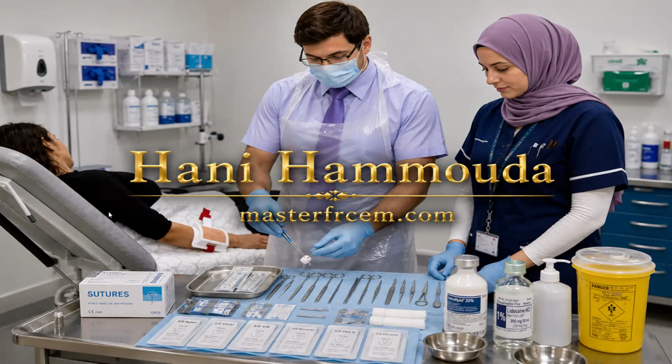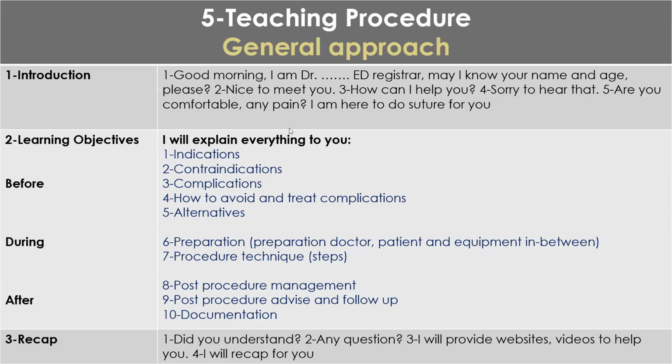Introduce yourself to the patient as usual, like any history. You will say, "Good morning," and so on. May I know your name and the age? Nice to meet you. Then smile. How can I help you? Oh, sorry to hear that. Are you comfortable? Do you have any pain? Then I'm here to do sutures for you because the wound is deep and gaping.